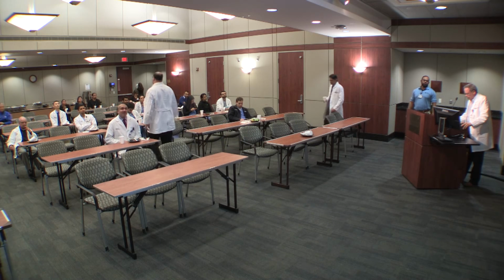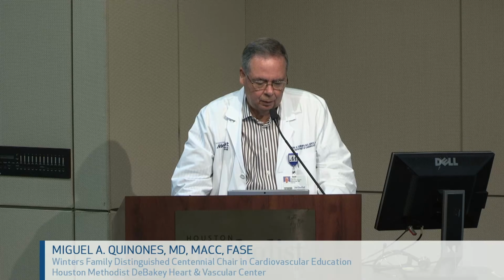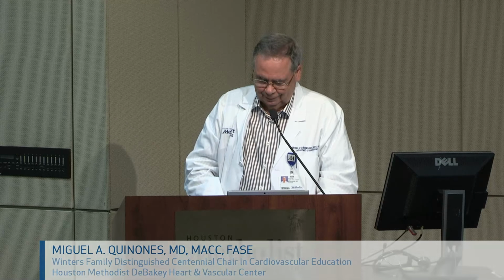Beautiful talk. And no question that gated CT is very important. Gated CT in assessment of the aorta overall is king.